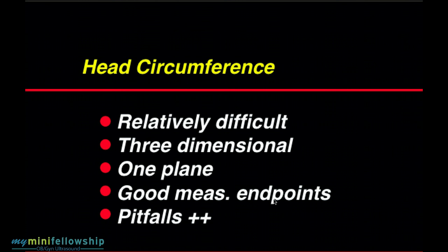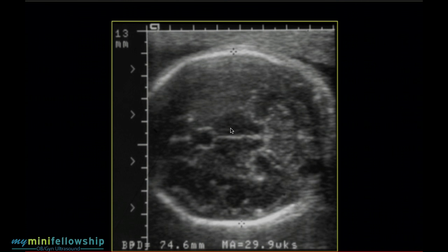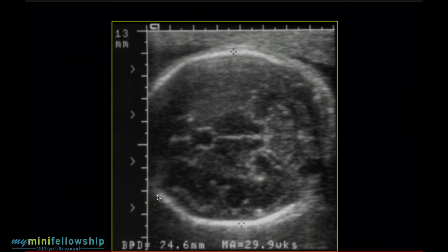Nonetheless, the endpoints of measurement are good. Again, we're measuring bone to bone — excellent measurement endpoints. So the pitfalls are reasonably few. What you want to see to know you're getting the measurement at the right level is the third ventricle flanked by the thalamic nuclei. That tells you you're at the correct level. How do you know that the beam is not inappropriately angled? You do that by looking at the calvaria. You want the calvaria to be perfectly symmetrical.